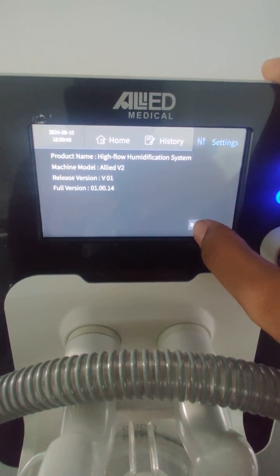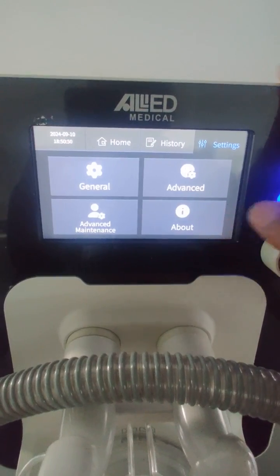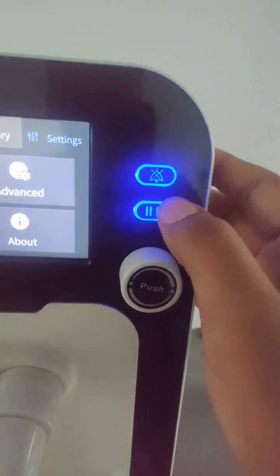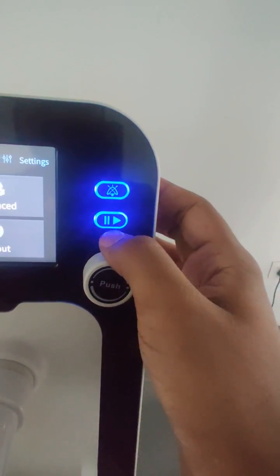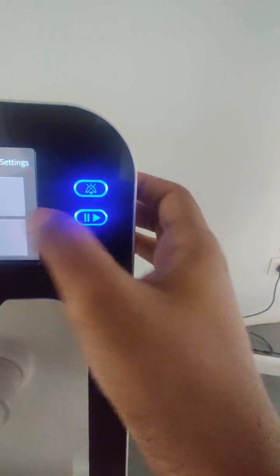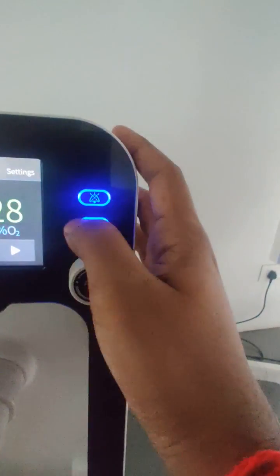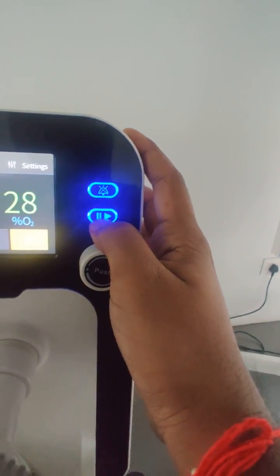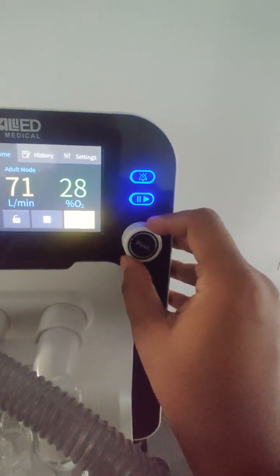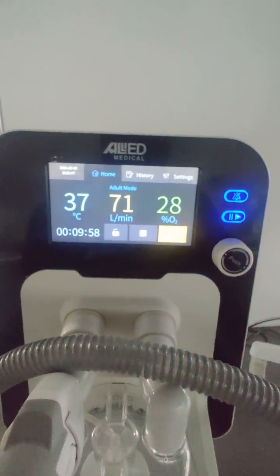On the right side of the device there are two physical buttons: one for silencing alarms, and one for starting or stopping the therapy. You can pause or stop therapy using that button, and the encoder knob is used for toggling between and adjusting different parameters.